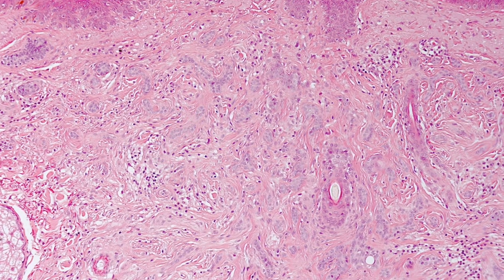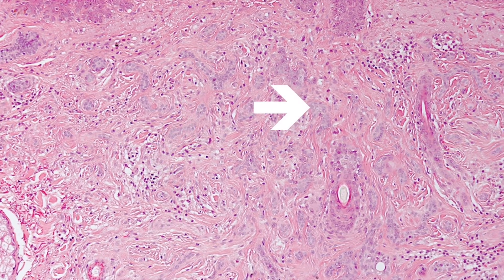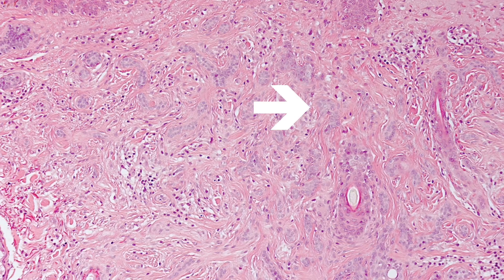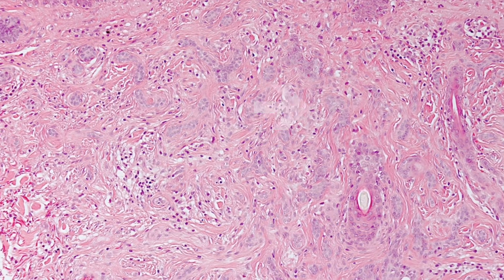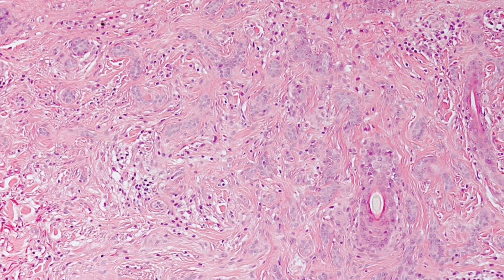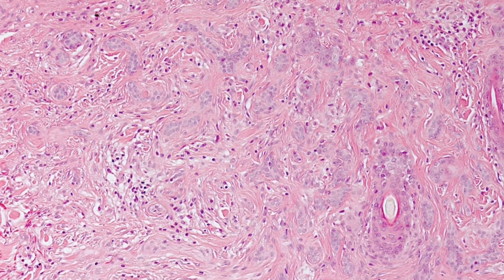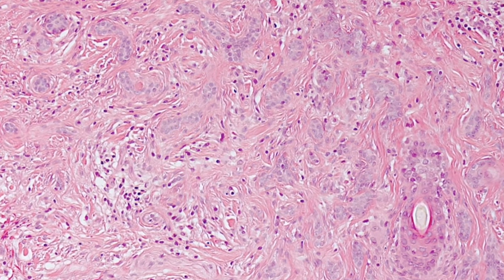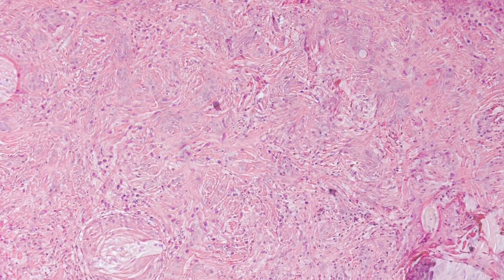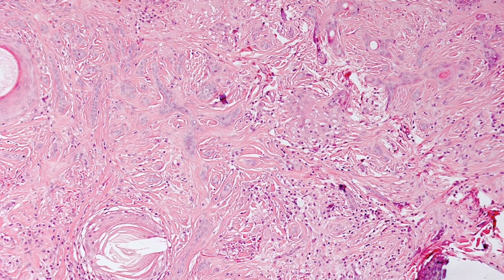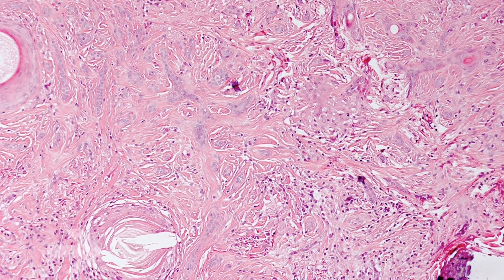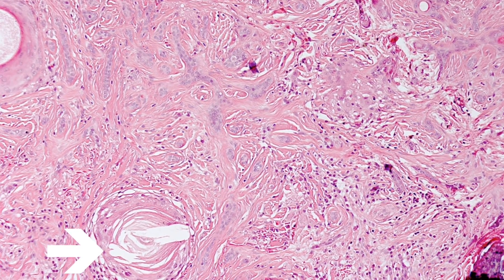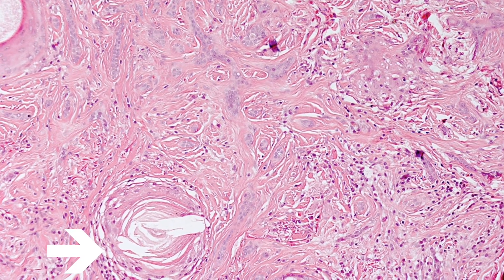On higher magnification, the strands of basaloid cells become apparent. And towards the left of the picture you can see horn cysts.